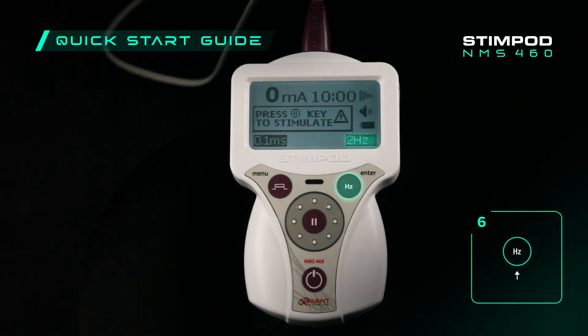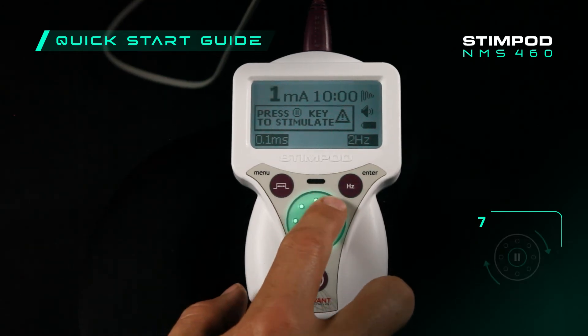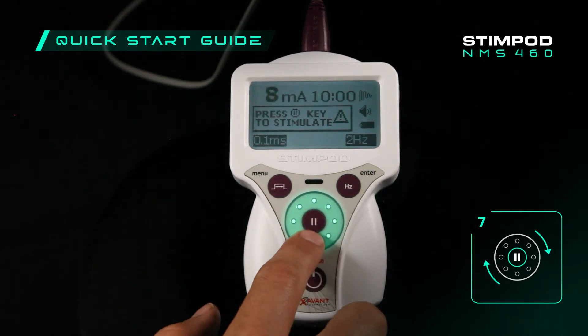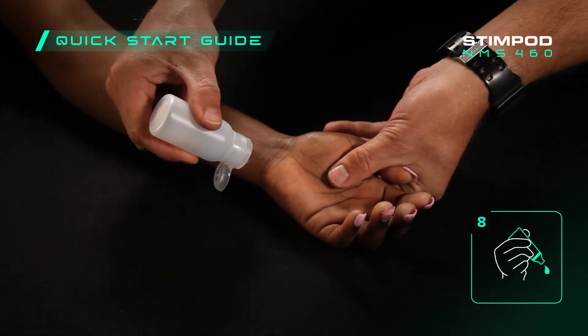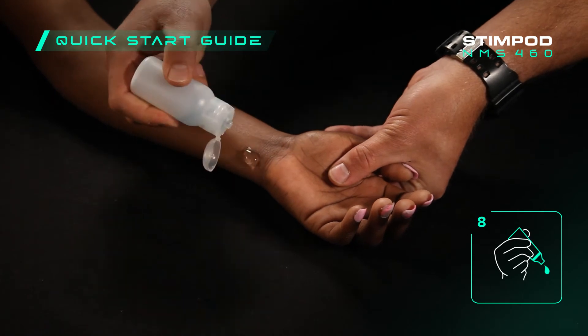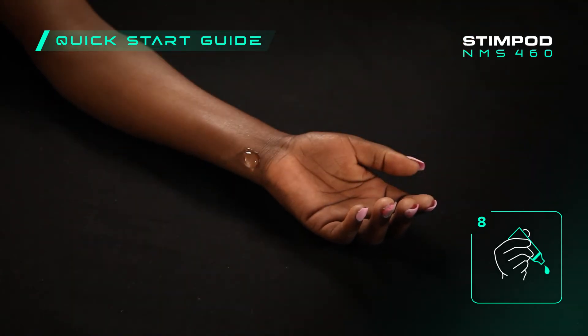Ensure the frequency is set to 2 hertz by pressing the hertz button. Adjust the current to 10 milliamps by rolling the adjustment wheel. Apply conductive gel to the treatment area — ensure that you apply a good amount of gel for optimum conductivity and to avoid any unnecessary patient discomfort.